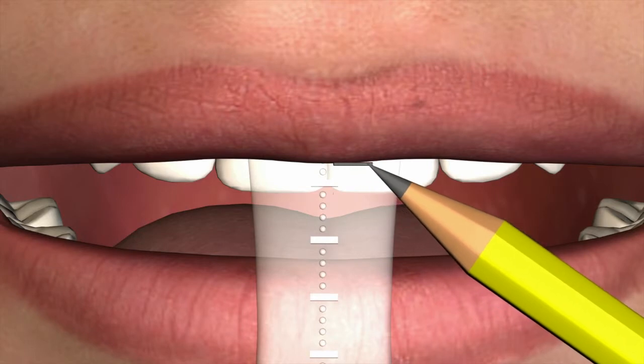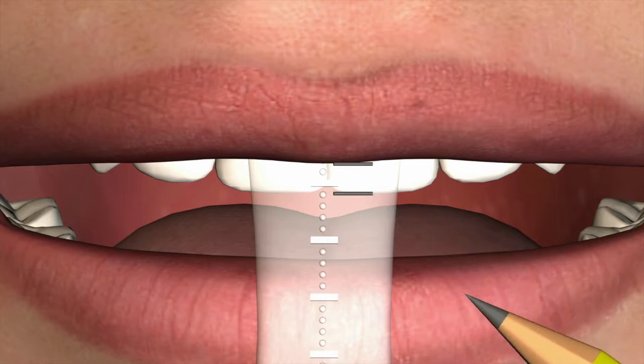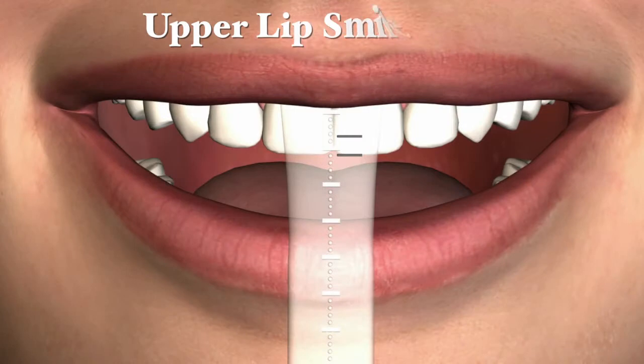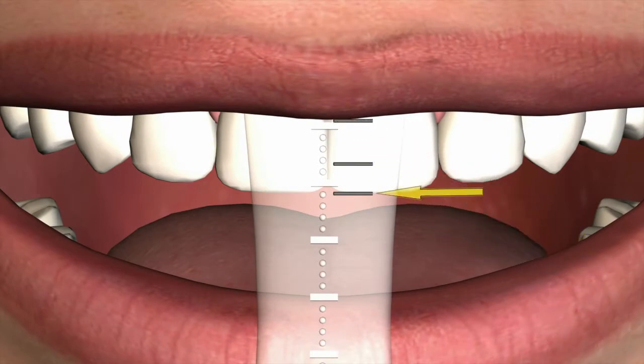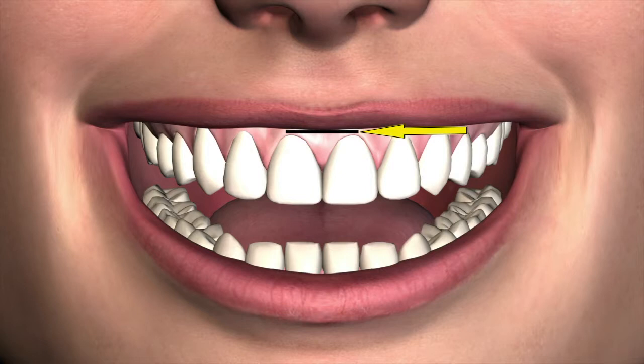Using a fine-tipped indelible marker, mark the vertical position of the resting upper lip as well as the vertical position of the maxillary central incisor teeth. If the patient presents with a gummy display, the position of the gingival line can be marked. Upper lip smile line: with the patient smiling, a marker is used to mark the highest position of the upper smiling lip, as well as the incisal edges of the anterior teeth. The gingival line can also be marked on patients with an excessive gummy display.